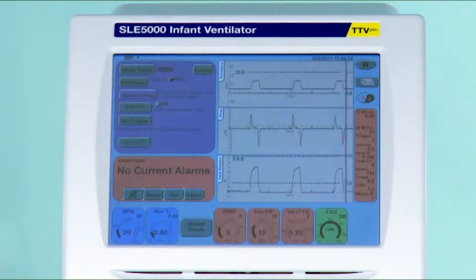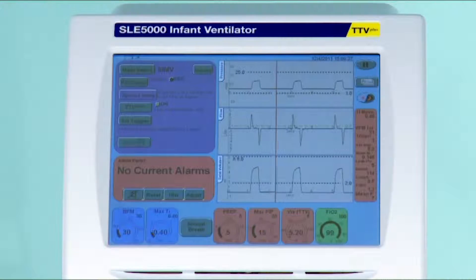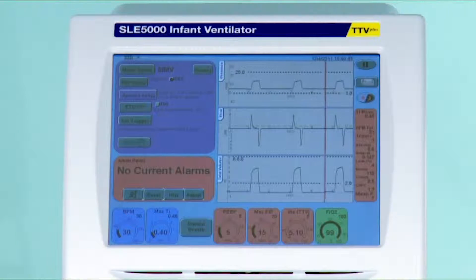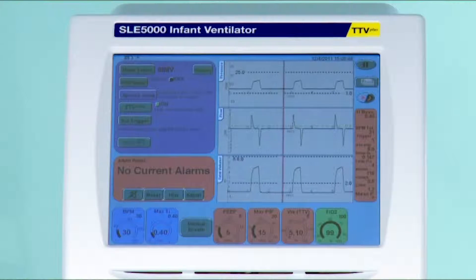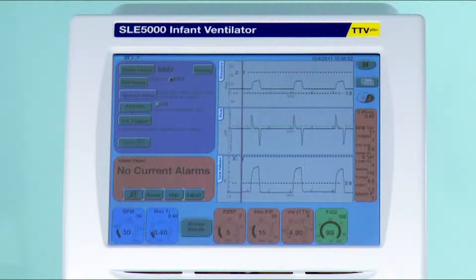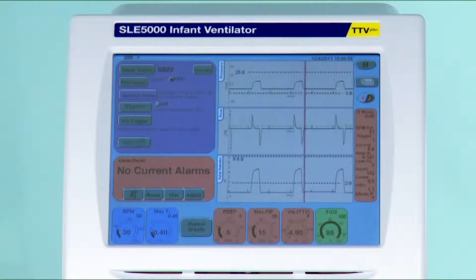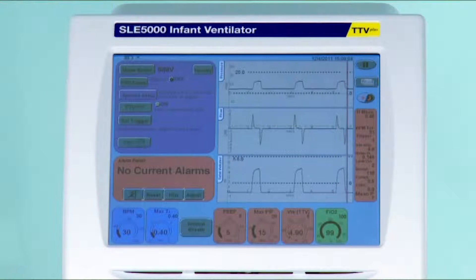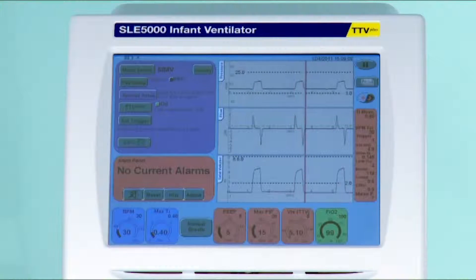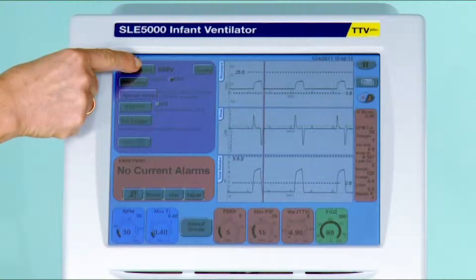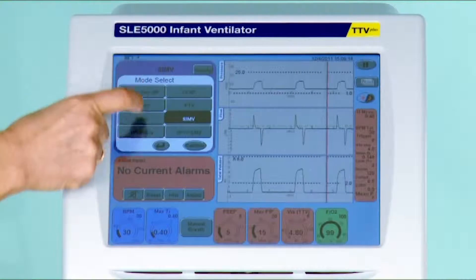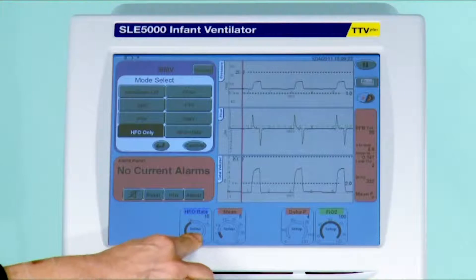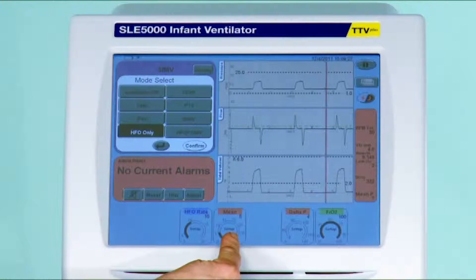Having now gone through all the conventional modes of ventilation, I'm now going to go to high-frequency oscillation ventilation. There are two modes here: high-frequency oscillation ventilation on its own, and a mode that combines high-frequency oscillation with conventional mandatory ventilation. With the SLE 5000, it is very easy to switch over — you can go from conventional ventilation to high-frequency oscillation ventilation without having to change the patient circuit, without adding anything into the circuit, or disconnecting the patient and thereby losing any recruitment you may have already achieved.